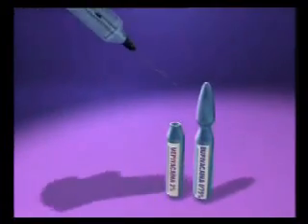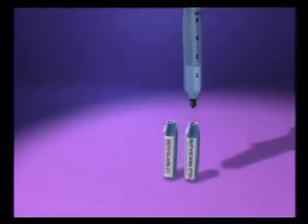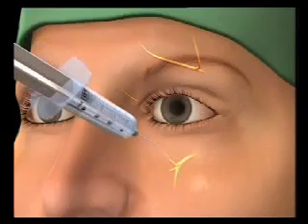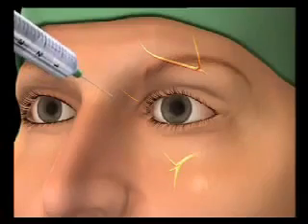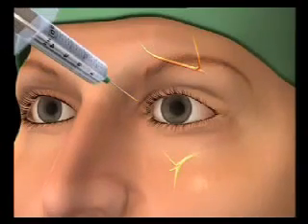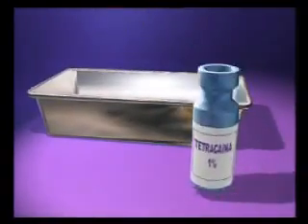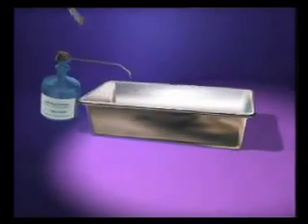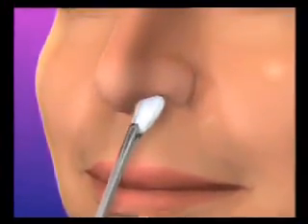The local anesthesia, a mixture of 1.5 milliliters of mepivacaine 2% and 1.5 milliliters of bupivacaine 0.75%, is infiltrated in the nasociliary area, blocking the infraorbital and infratrochleal nerve with 1 milliliter of anesthesia in each area. For the topical anesthesia, a cotton swab is impregnated with a mixture of tetracaine 1% and epinephrine 1/100,000th and placed in the nasal fossa about 15 minutes before surgery.